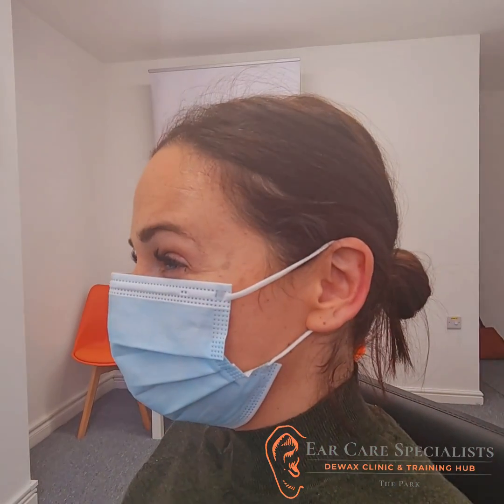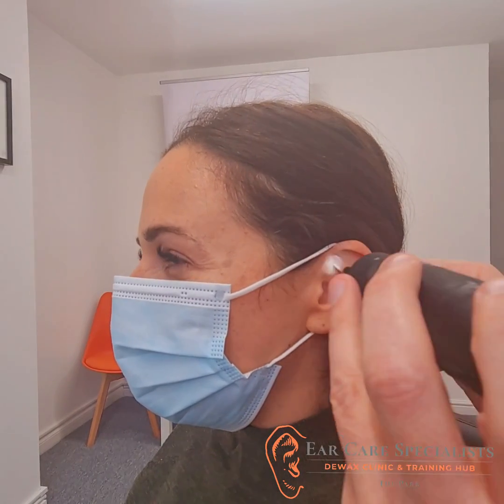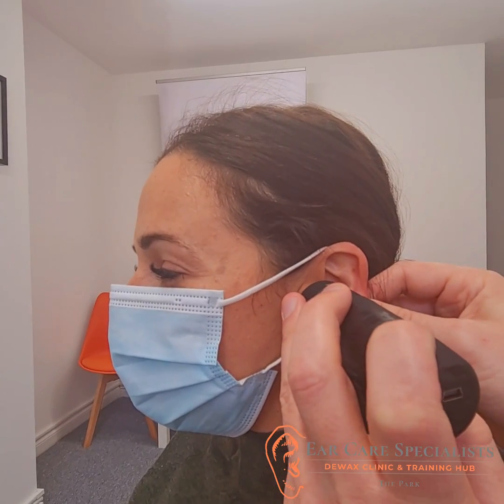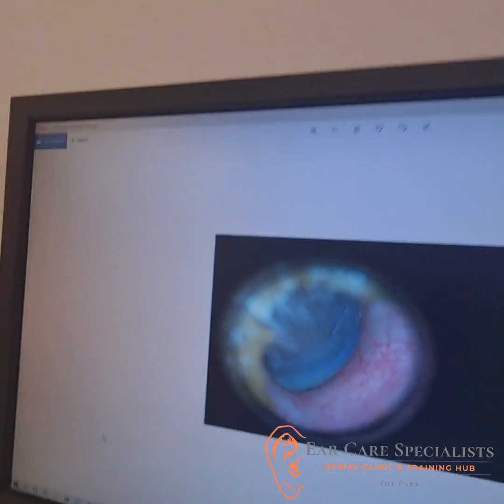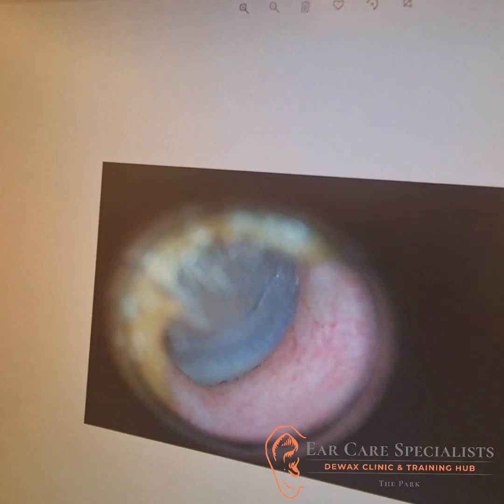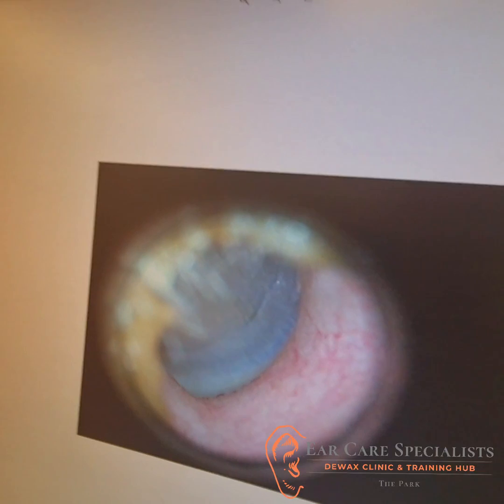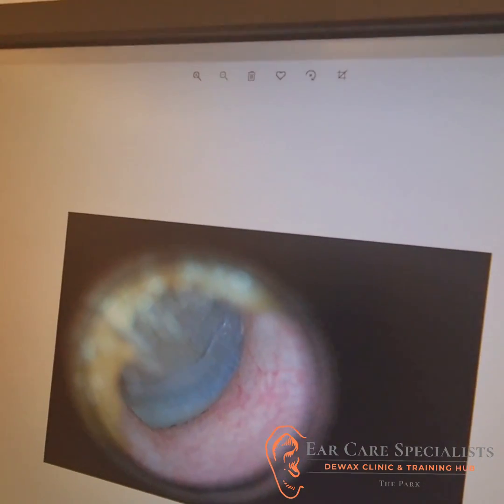I'll just have another look in your ear just to make sure that we've got everything out. Let's take another picture. So that's what we can now see — we can see the eardrum. There's still a little bit of residual wax there, which is quite fine. A little bit of wax in the ear is fine; we're not trying to clear everything. But it's clearly removed the obstruction so that we can proceed with our clinical processes.